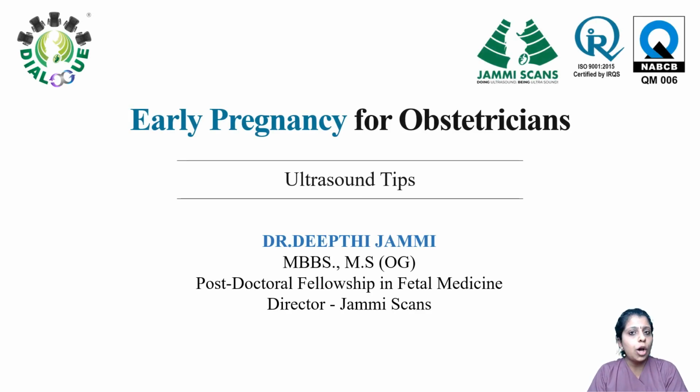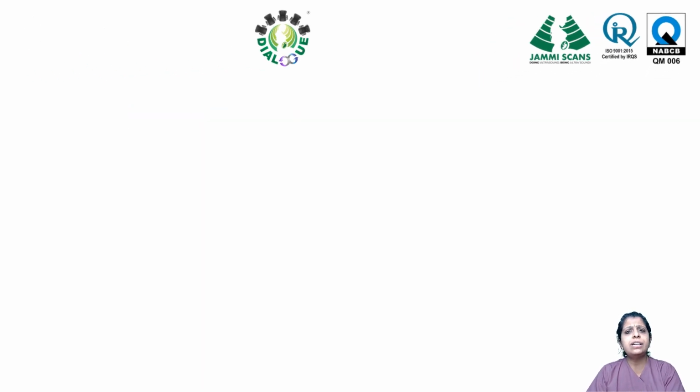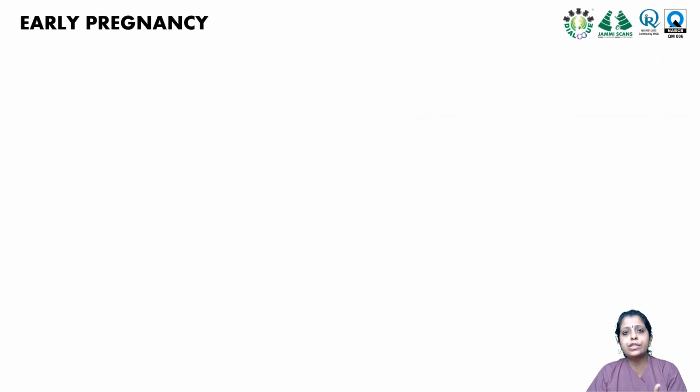So today we are going to talk about a very important topic in obstetrics, that is the early pregnancy scan, and that too ultrasound tips for each and every obstetrician, which would be very helpful in your day-to-day practice. The first thing about early pregnancy, all of us know, most of us do our early pregnancy scans as well.